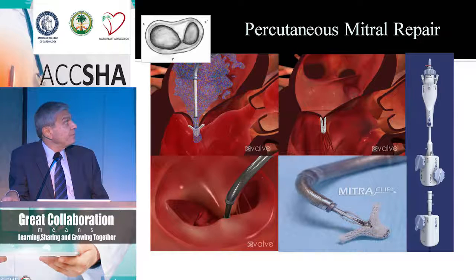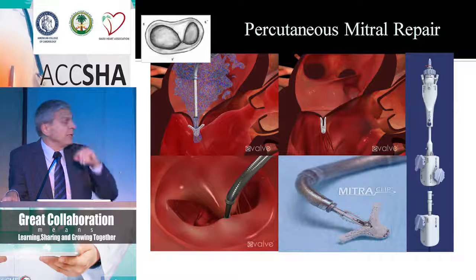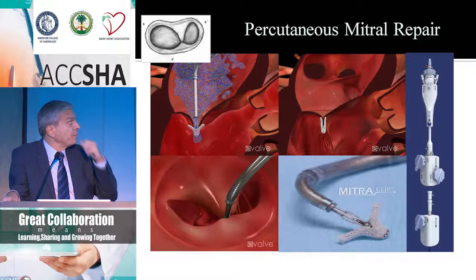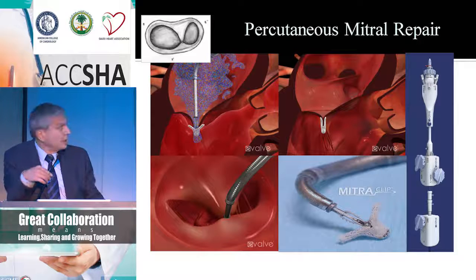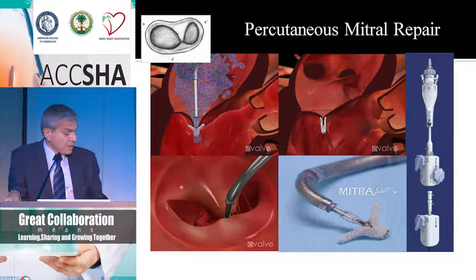You cross the septum, usually superiorly and posteriorly, so that you can have a reach into the left atrium, left ventricle inflow. And you advance, this is your needle, then you advance your device, you drop down into the ventricle, you catch the two leaflets, you confirm reduction of the mitral regurgitation to hopefully down to 1+, you create your double orifice, and then if everything is fine, then you release your clip. And you can verify this also by your fluoroscopy.